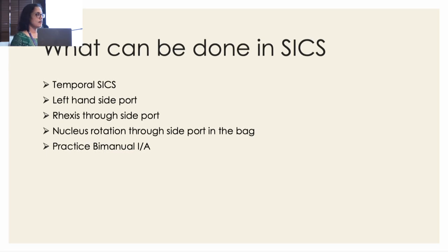Left hand side port is one thing which is not in SICS but which is very important in phaco. So do a left hand side port, and if you are more comfortable doing the rhexis through the main port, which is a very big 5 mm sclerocorneal tunnel, please do the rhexis through the side port. Try to do side port. So these all things will help you to do your future phaco.